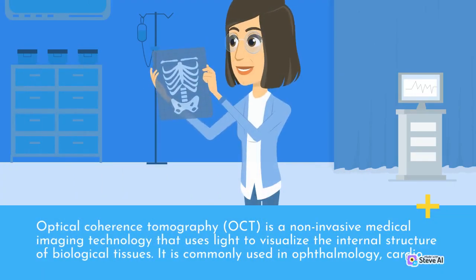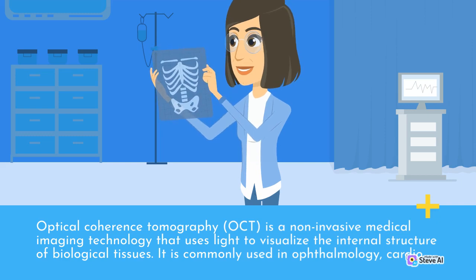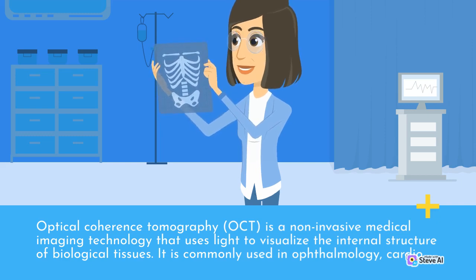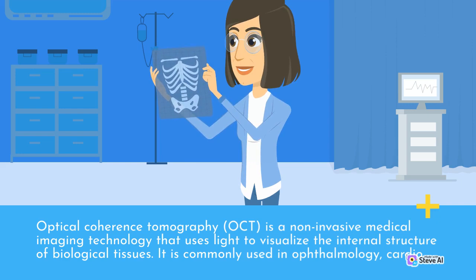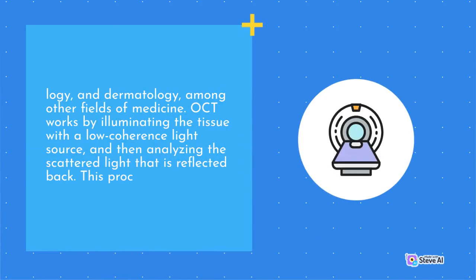Optical Coherence Tomography, OCT, is a non-invasive medical imaging technology that uses light to visualize the internal structure of biological tissues. It is commonly used in ophthalmology, cardiology, and dermatology, among other fields of medicine.